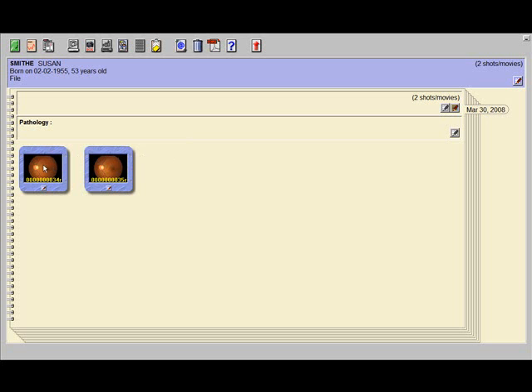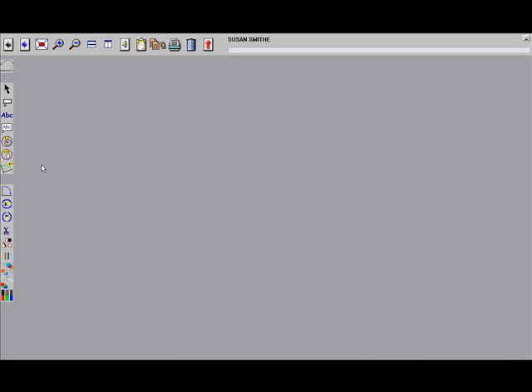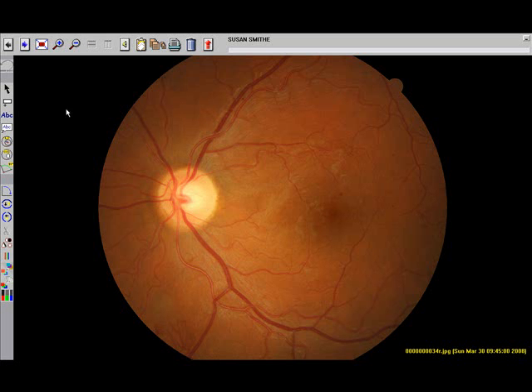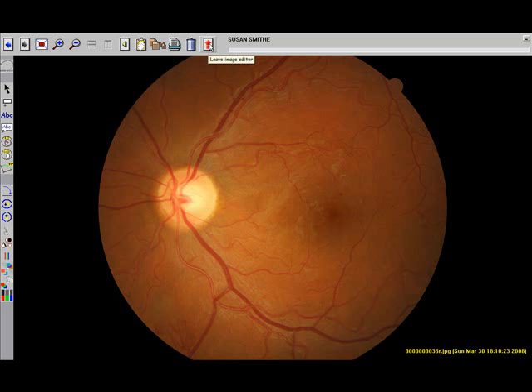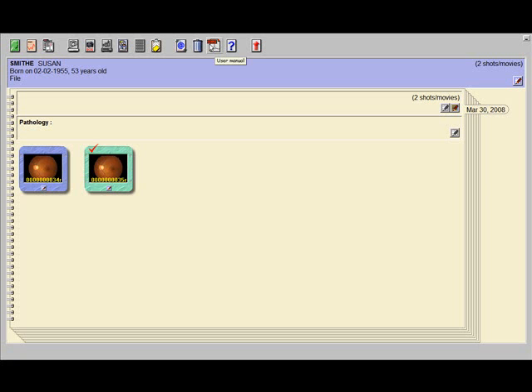To review the images, click on the center of the image. To review the next image, use the arrows in the upper left-hand corner. When done, press the red arrow to return to the thumbnails. If you wish to view two images side by side, hold the Control button down on your keyboard and highlight both images, then right-click.